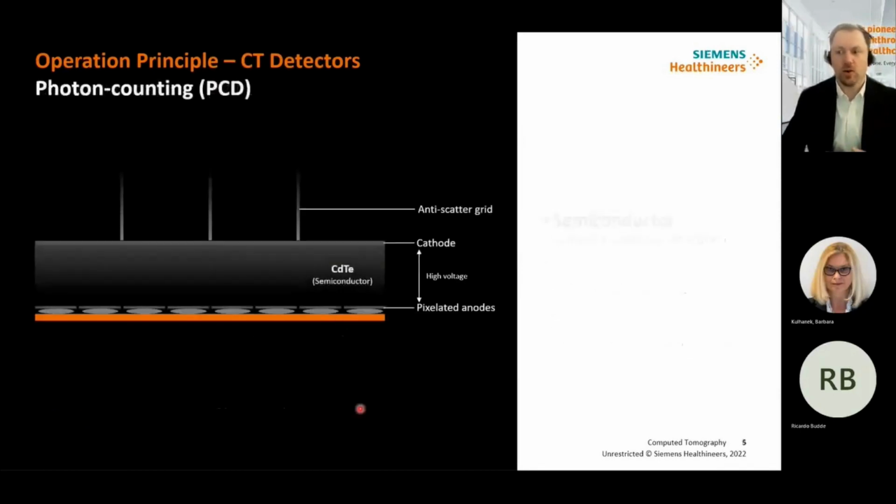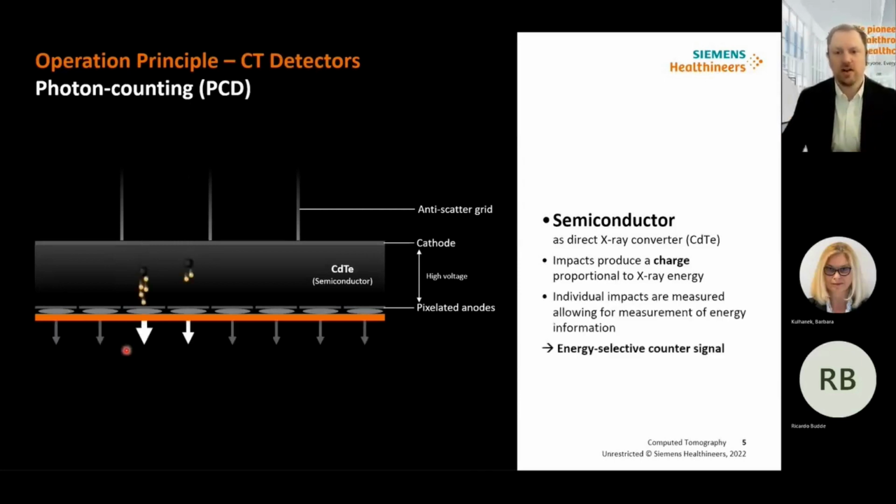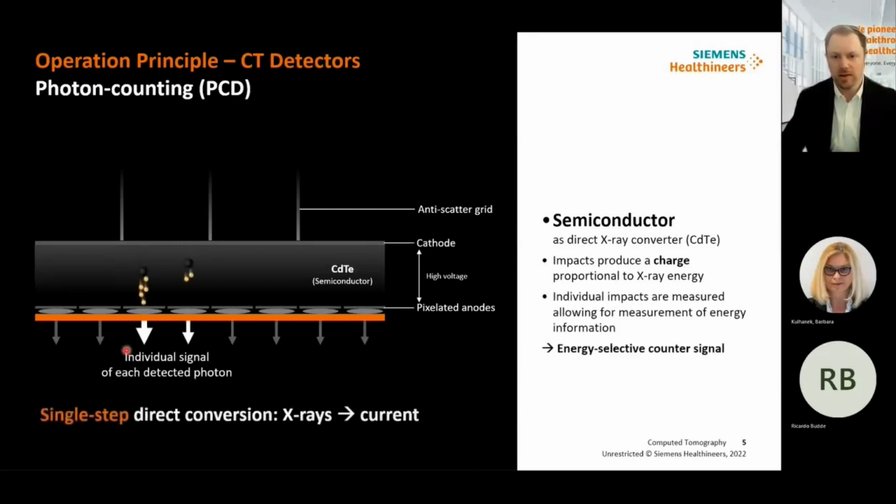With a photon counting detector or a semiconductor material, that's different. No longer a ceramic scintillator, it is a crystal semiconductor. The easiest things to see right away is those walls between elements are gone. We no longer need to control light because there is no more light. This is now a direct conversion from an X-ray impact to an electrical current. The other thing that you'll easily notice is that the detector elements are smaller. Siemens has been leading the industry with the Somatom Force for a number of years.